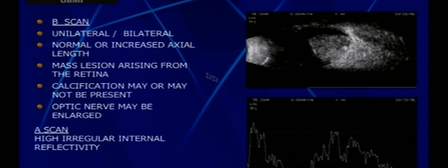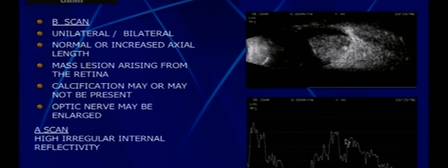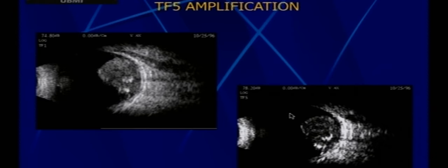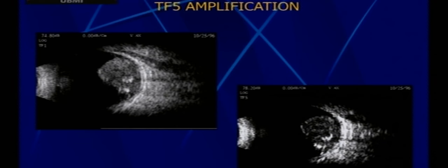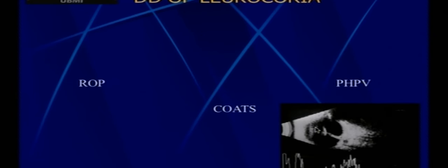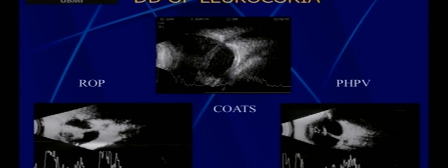Retinoblastoma shows a mass with calcification on ultrasound — a fantastic diagnostic picture. However, calcification occurs in only about 50% of retinoblastomas. A-scan is very helpful: it shows an irregular A-peak helping differentiate retinoblastoma from other conditions. Importantly, retinoblastoma has micro-calcifications that may not be visible at high gains — changing the gain settings makes them very apparent. Always play around with machine settings to make findings more apparent.